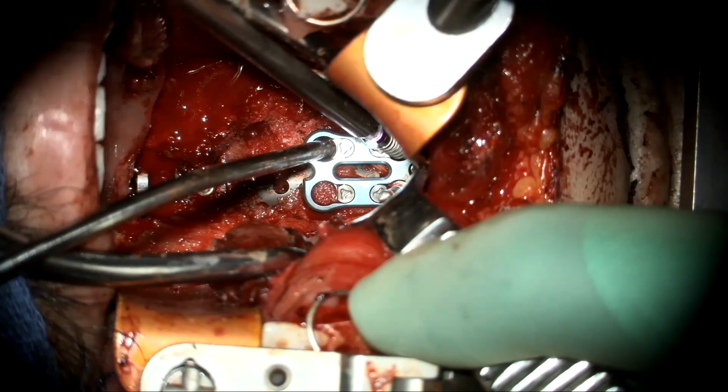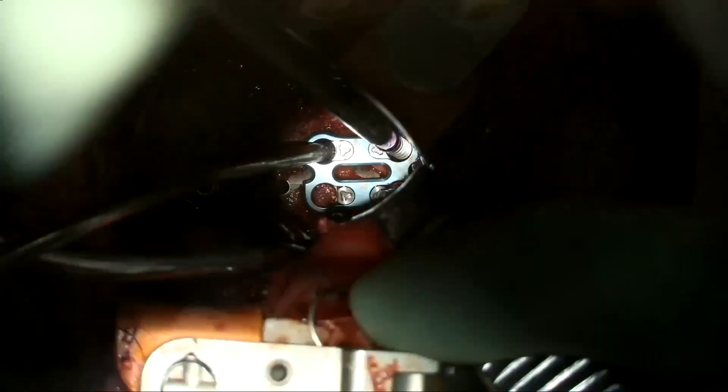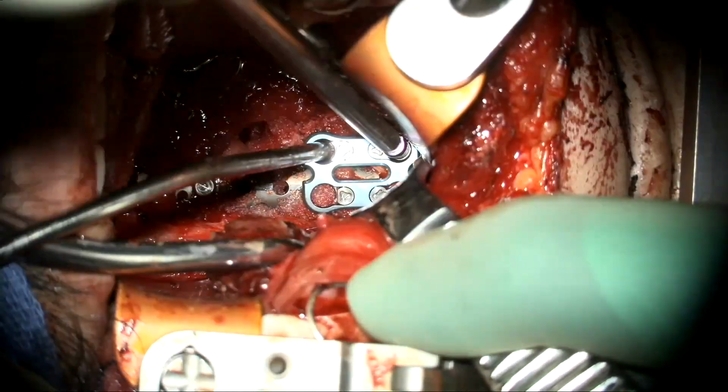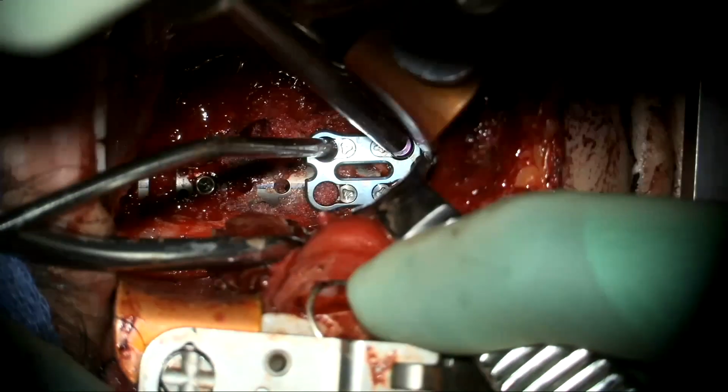A buttress plate was fixed over the inferior aspect of the cage and anchored onto the C5 vertebral body for stability. Then the otolaryngology team proceeded with closure.